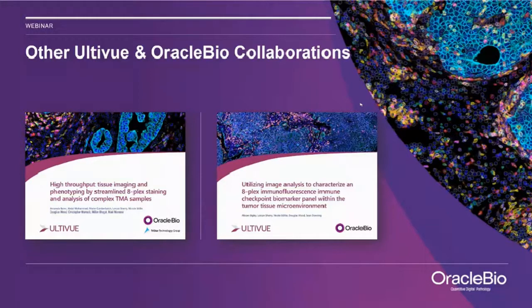There are other things that we should probably consider when thresholding as well. Things like background and non-specific staining across a set of images can have an impact on how the thresholds are chosen. And these can present in different ways depending on the number of study samples. Things like necrosis can have a lot of background staining associated with it. Diffuse blood cells and collagen structures can have autofluorescence. And from an assay perspective, the antibody specificity can also lead to some non-specific staining.